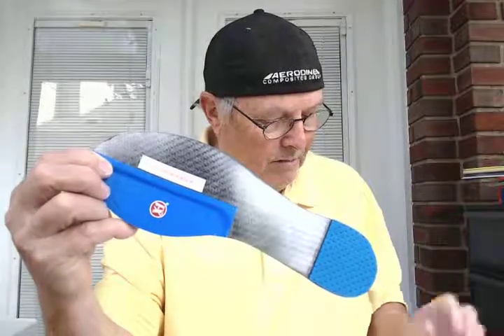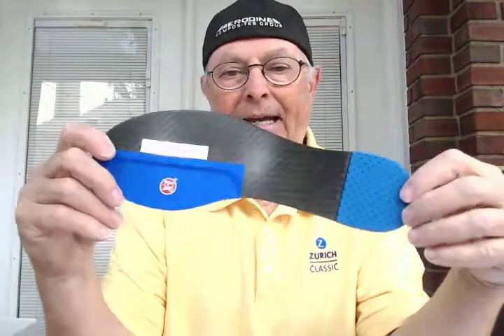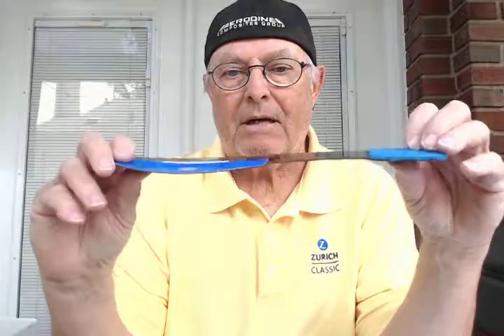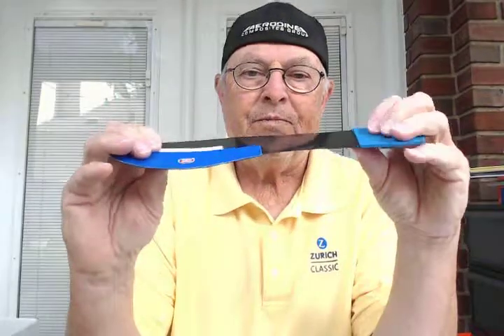So he got one of my X1 Blade Fusion Plus Plus models and he got an X1 Blade Lite model. The Fusion model is very rigid under the Great Toe, but it's flexible in the ankle so it won't impede his gait pattern.